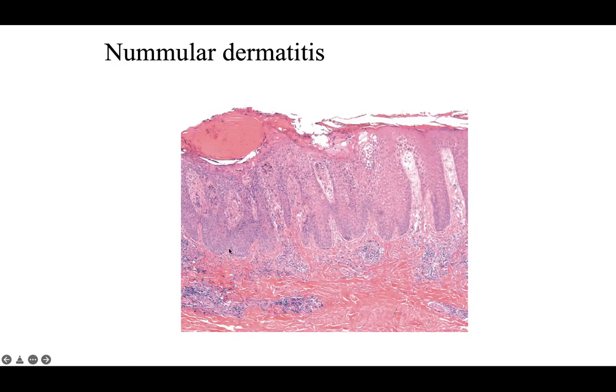And you could get really into thinking that this is a psoriasiform hyperplasia, but you'll notice these suprapapillary plates are quite thick. You'll also notice some really good areas of preservation of the granular layer. And there's not a really great amount or abundant amount of neutrophils here. This is in a thick stratum corneum. And if you go in higher power, you'll probably find more eosinophils to argue against the psoriasis.